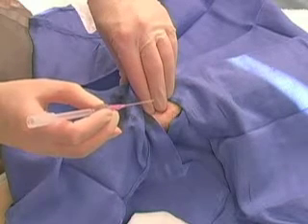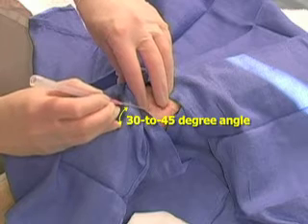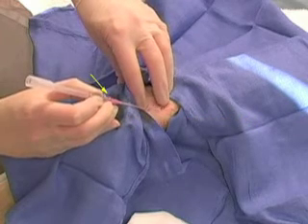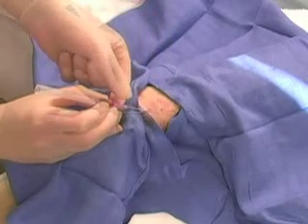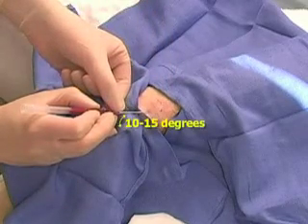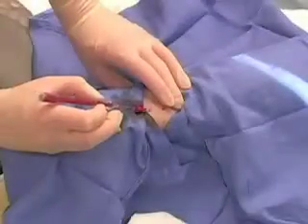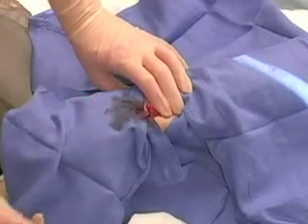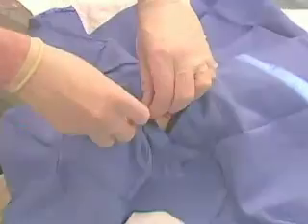In the over-the-needle technique, an angiocath is used and advanced at a similar 30 to 45 degree angle. Once blood return is obtained, the needle is advanced slightly farther to assure that the catheter has entered the vessel. The needle angle is then lowered to 10 to 15 degrees, and the catheter is advanced into the vessel. Proximal pressure is applied to the artery, and the needle can then be removed, and the catheter can be connected to the transducer system.